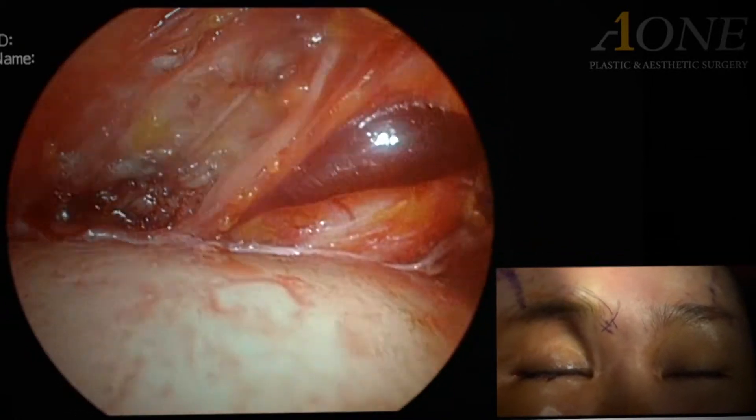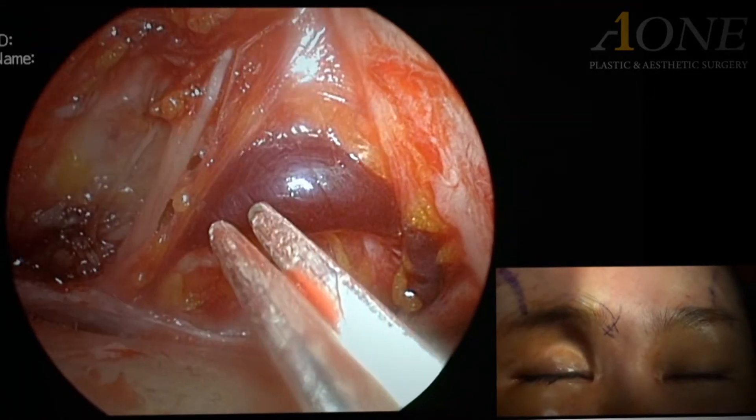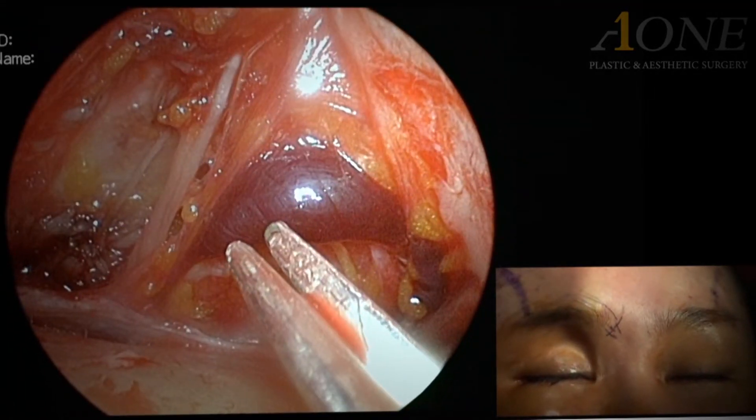What you see now is the nerve. The dark red tissue is blood vessels. An advantage of endoscopic surgery is that this tissue is saved.